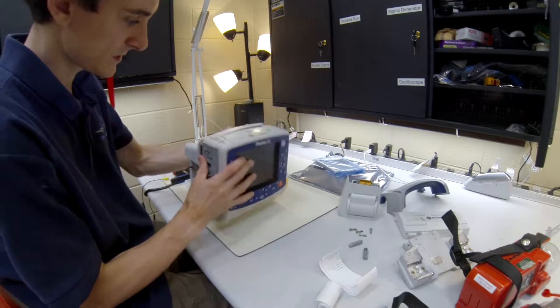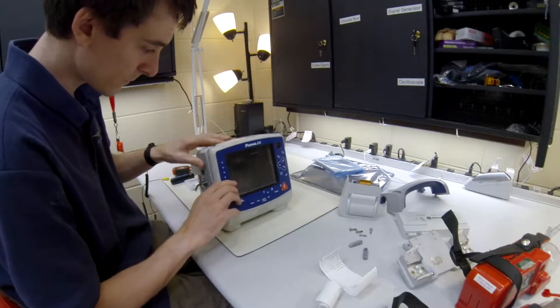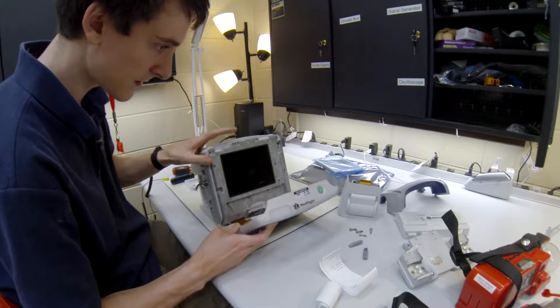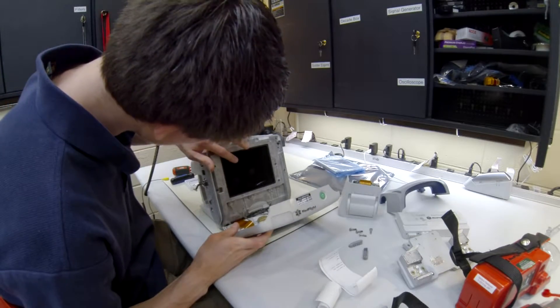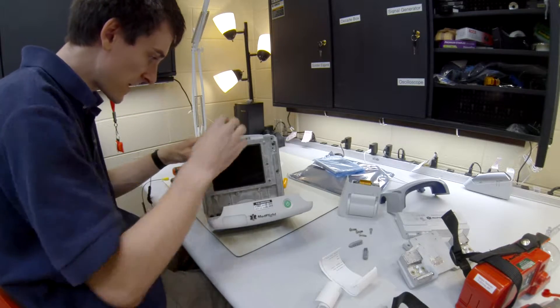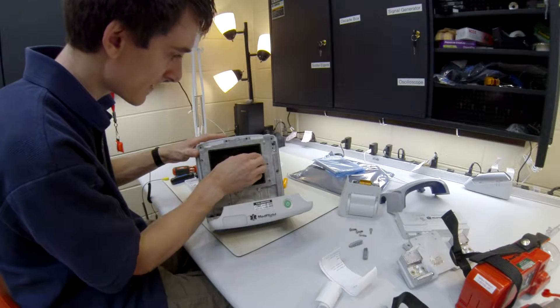I got the whole unit dismantled. The part that we want is this whole front assembly right here, so we're just going to pull this off. That whole LCD screen is pretty much shattered — actually, it is shattered.